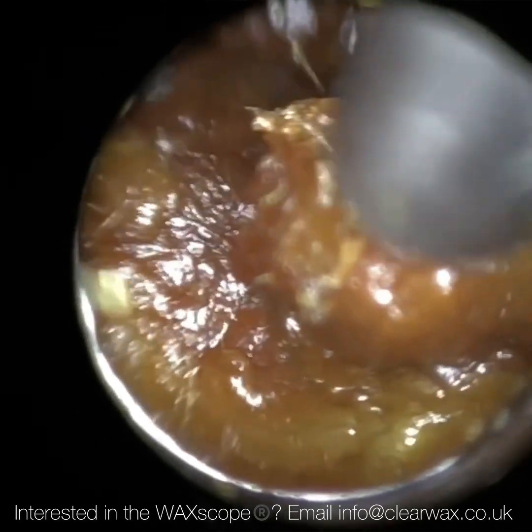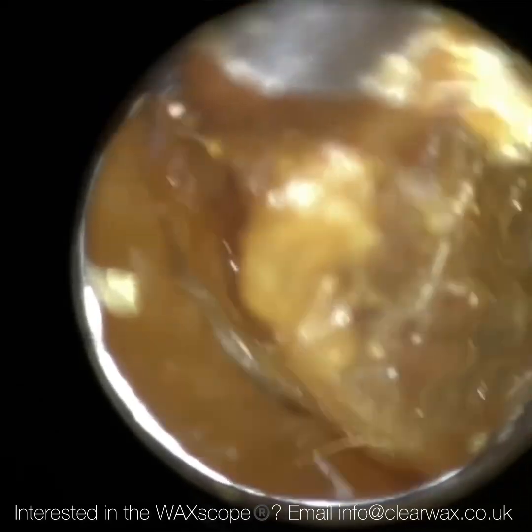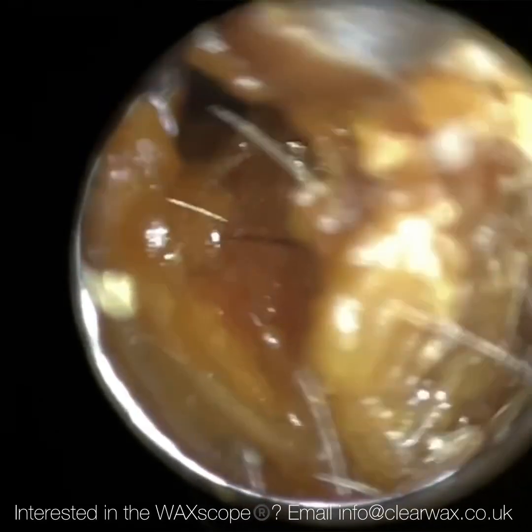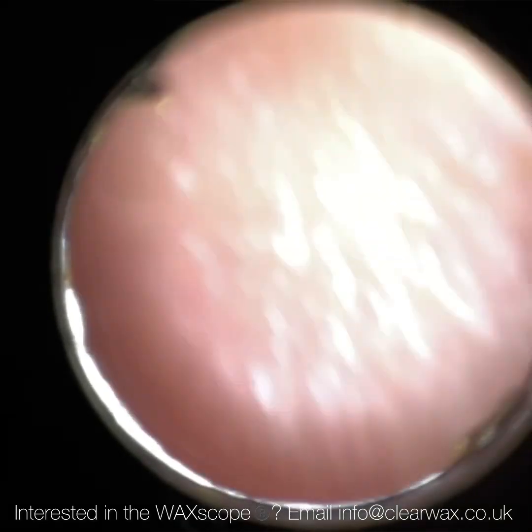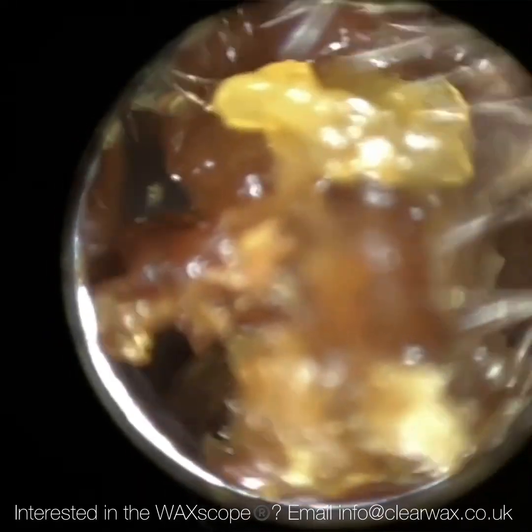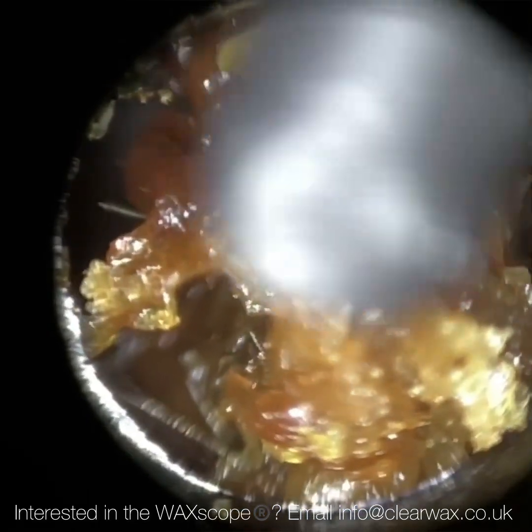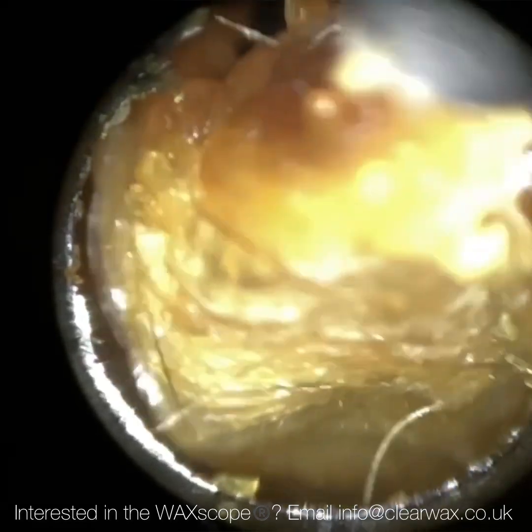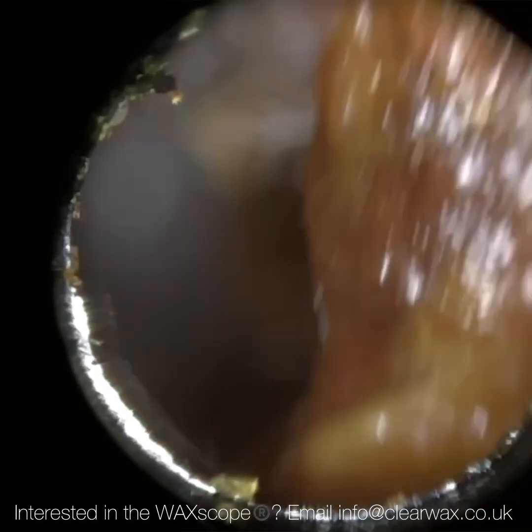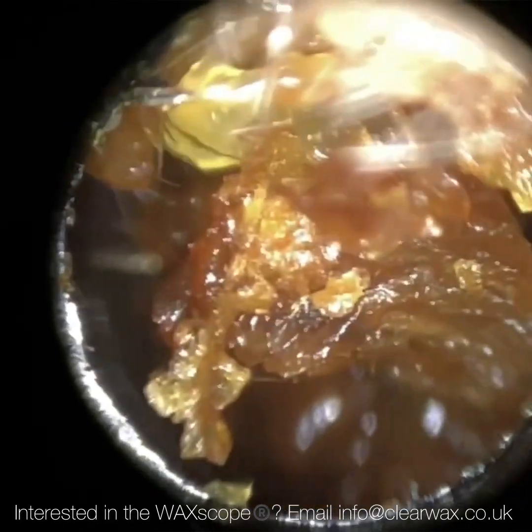If someone is having earwax removed and they're not using an endoscope, the most likely method is loupes. So if you're one of those people, you are aware of the difference now. And I would like to think, after seeing the comparison, the Waxscope is far superior. But that's up to you guys to decide. And if you're having your ears cleaned, that's obviously your decision, what type of view you would prefer your specialist to have when doing the procedure.